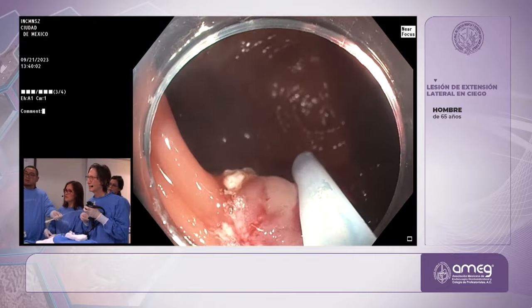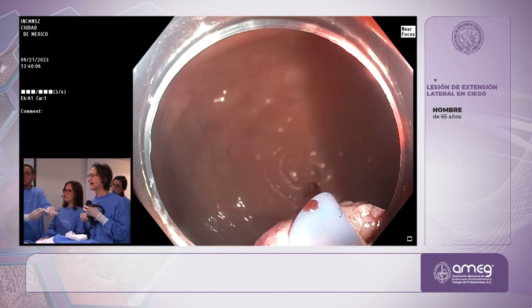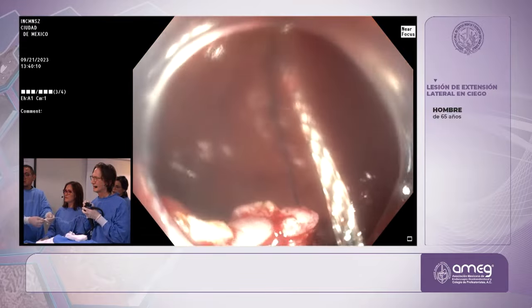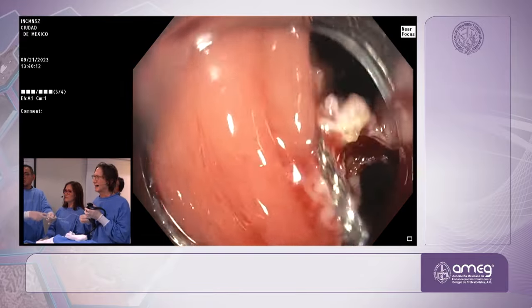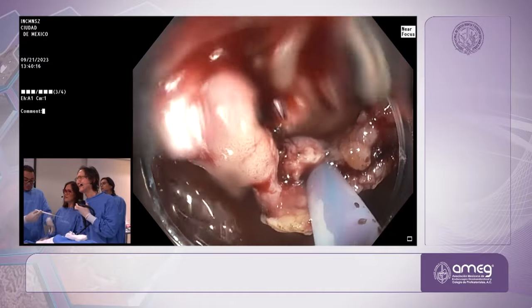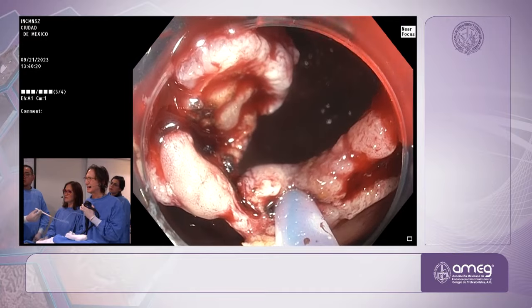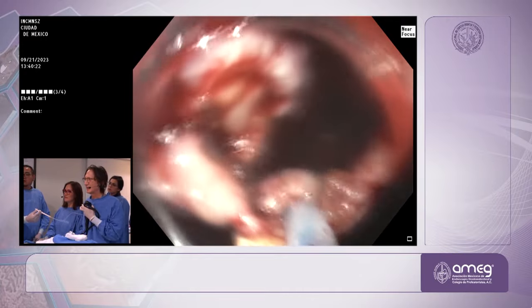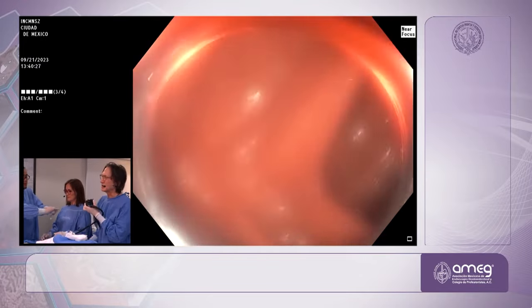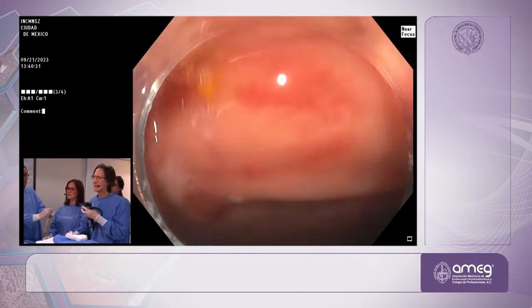Open. Abre. All right, now close this again. So okay. I think it's just kind of hanging there. All right, let's just take this off. All right, okay. Let's take a look now. I want to do some hemostasis, and then we'll do some trimming to get everything clean.